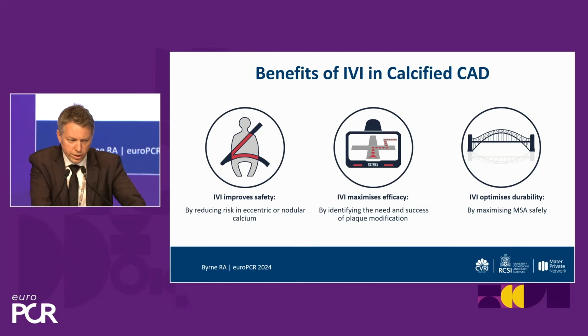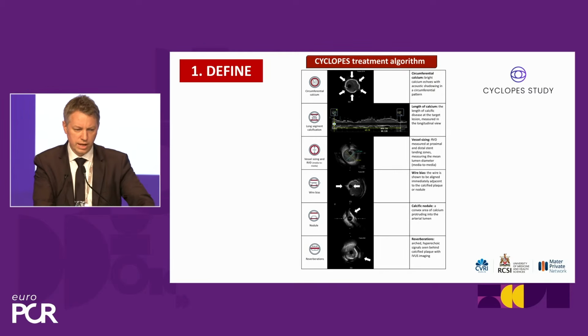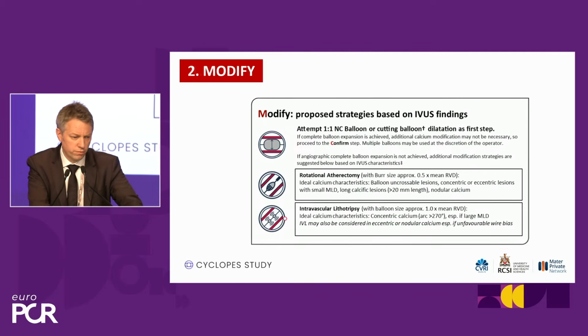I think we know very well the benefits of intravascular imaging in calcific CAD. Otherwise, I think we're treating in the dark. It improves safety, it enhances efficacy, and it optimizes durability of results. So our algorithm is imaging based. So we've talked about defining calcium, circumferential, long segment, vessel sizing, wire bias, nodular calcification, and reverberation.